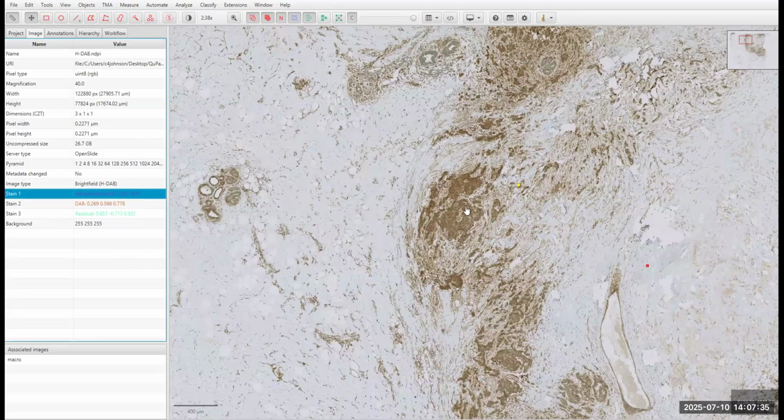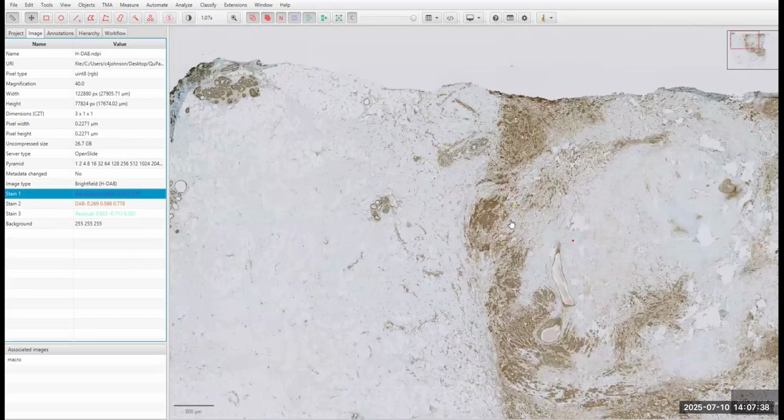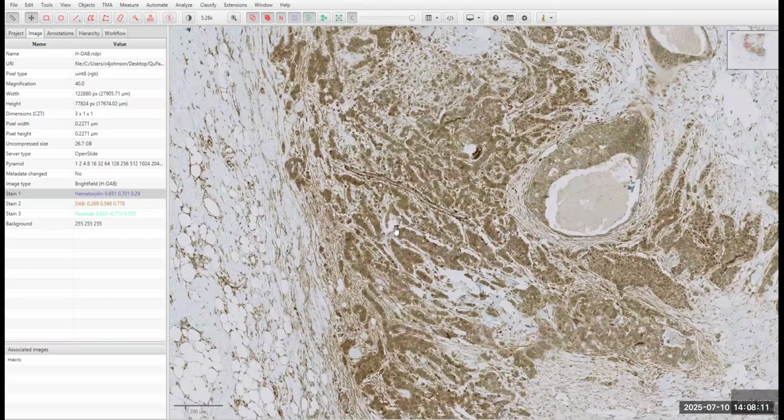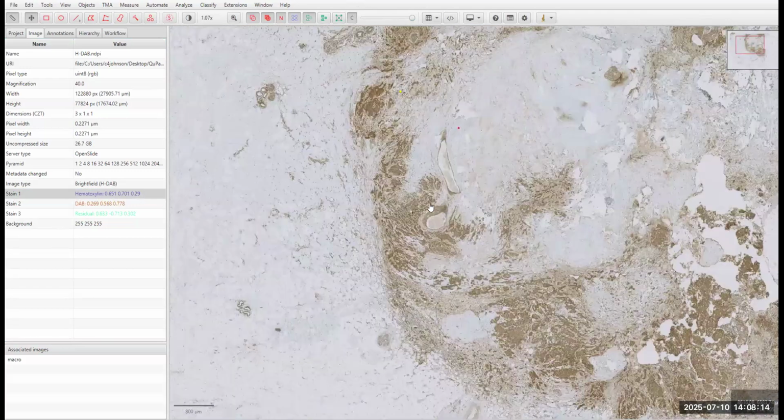Now, QuPath can use Z images and time images. That's new to version 0.6.0. Previously, it wasn't really. You could do it, but it just didn't work very well. Apparently, this one is much, much better. You will get some sliders up the top here. This is for channels, but you will get one for Z and time that you can then cycle through. But I don't recommend doing it here. There's other software that you can use, but I suppose if you're stuck, it's not the worst thing.